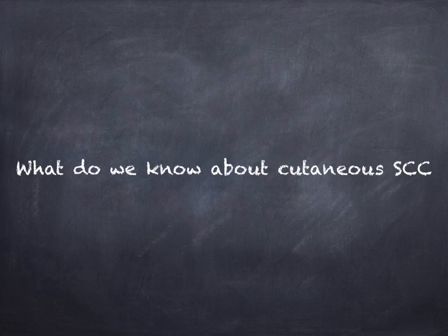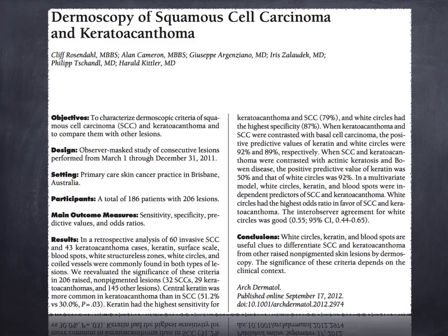First of all, what do we know about the squamous cell carcinoma on skin? Since 2011, there were several papers describing the features of SCC on the skin. In these papers, the authors analyzed more than 200 lesions, and several criteria have been reported including the presence of a central keratin, more commonly seen in keratoacanthoma, and white circles that were the most specific features, as well as blood spots and keratin and white circles altogether, which in a multivariate model were independent predictors of squamous cell carcinoma.